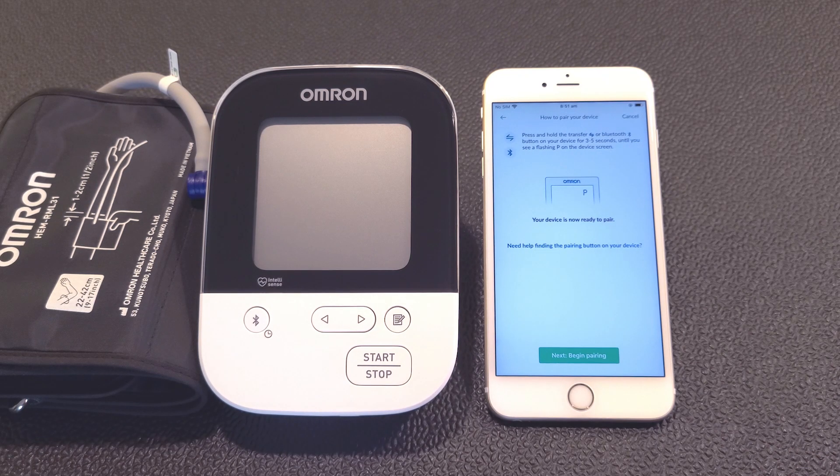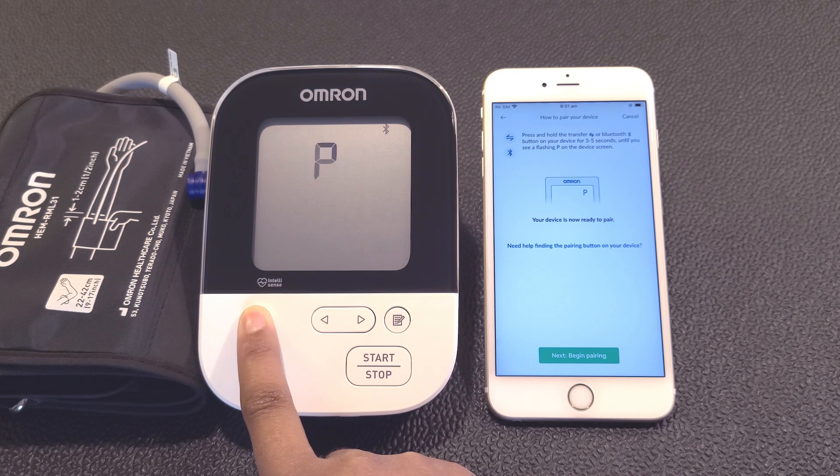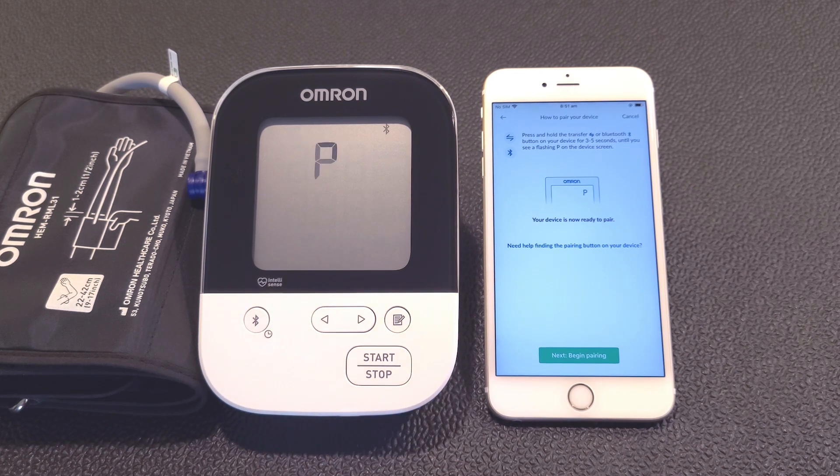To put your blood pressure monitor in pairing mode, make sure your monitor is powered on and then press and hold the Transfer button on the monitor for 3 to 5 seconds. A capital letter P for pairing will flash on your monitor.